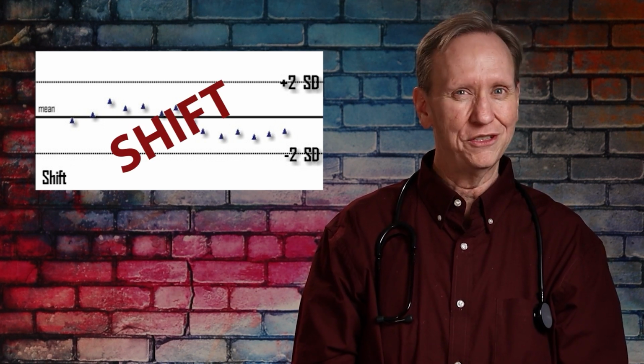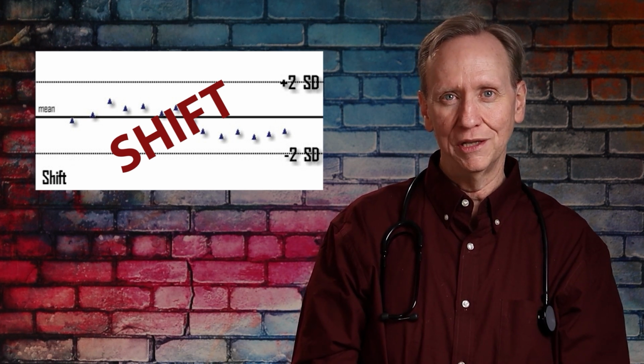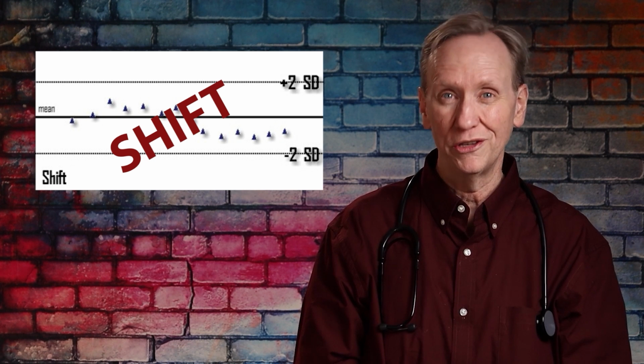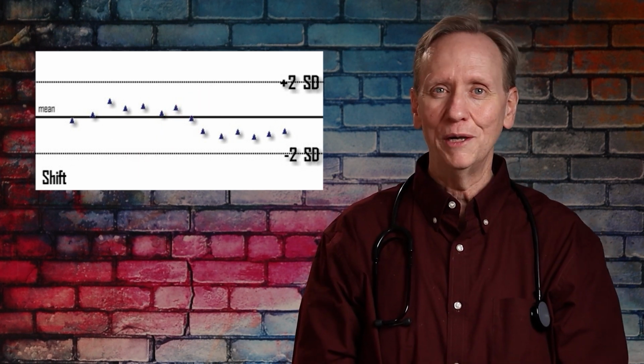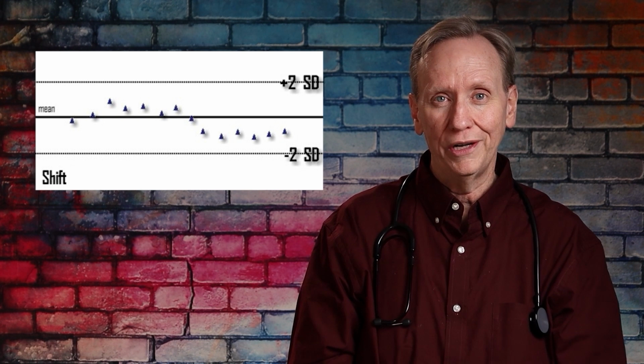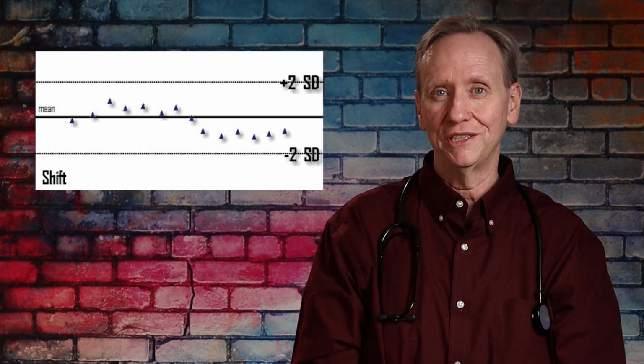Shifts are kind of less dangerous than trends because things shift all the time in a blood gas lab, and the main reason why you would have a shift is because the weather changed outside. Probably the barometric pressure changed, there's a storm moving in. So we look at shifts and think, oh, well, whatever, as long as they're still inside the control limits, then this blood gas machine is still in control.